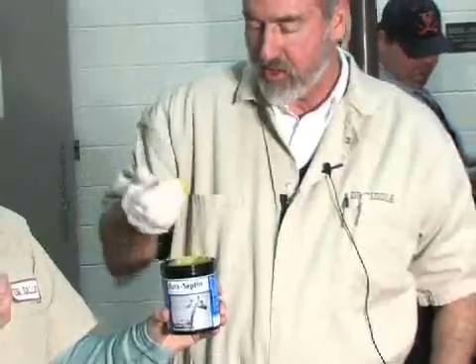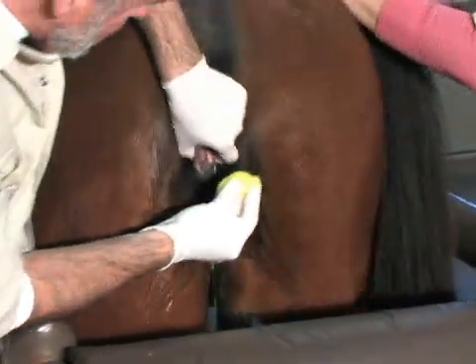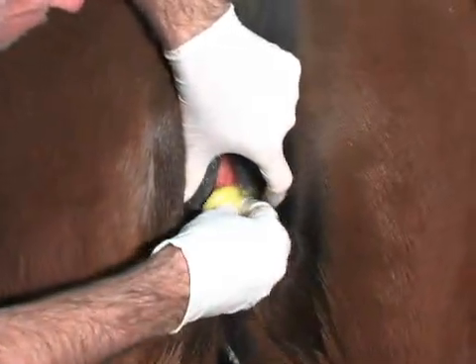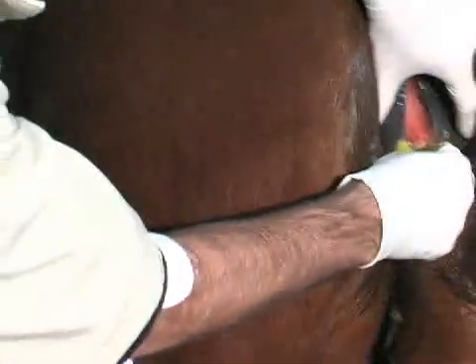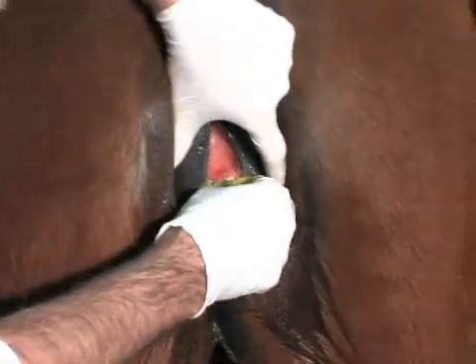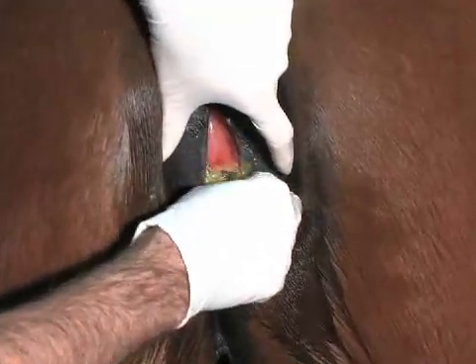Then we're going to pack this fossa and sinus region with nitrofurazone ointment. Silvadine cream has also been used, but I'll typically use nitrofurazone. You want to make sure that the entire fossa region is packed with the nitrofurazone, and then you also want to massage the nitrofurazone well into the clitoris.